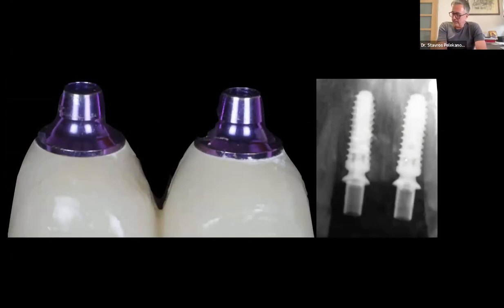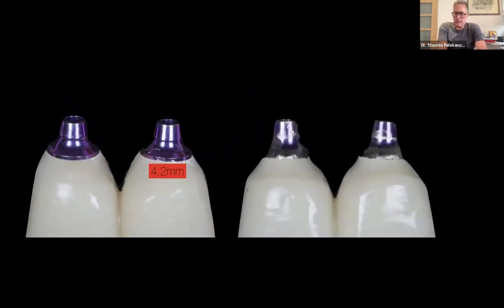Even companies till today, I don't really understand why they are producing titanium bases that are really big and wide. For example, in case we want to create the transmucosal contour already from the deep zone or the transitional zone, then we have problems. Many times in my practice, I need to reduce tie bases, like in this example where I have two central incisors, and I had to do it manually.